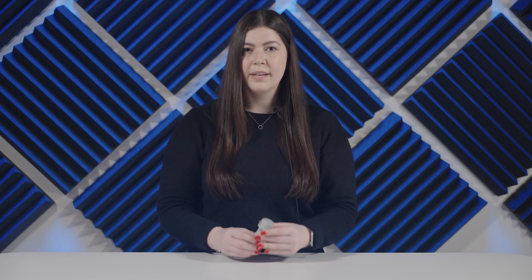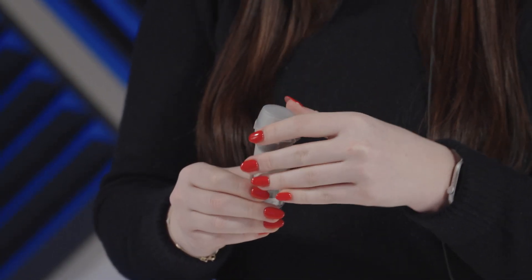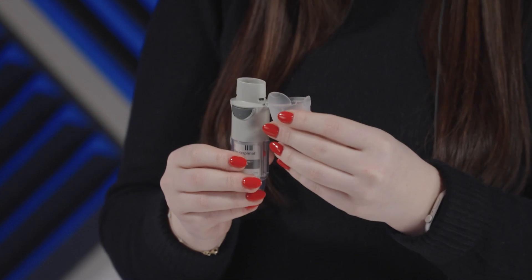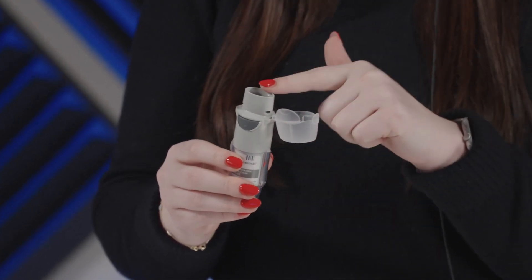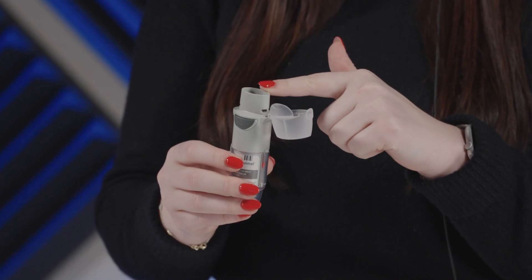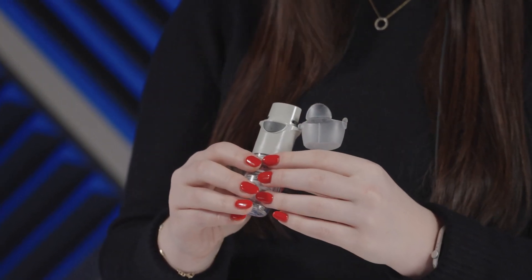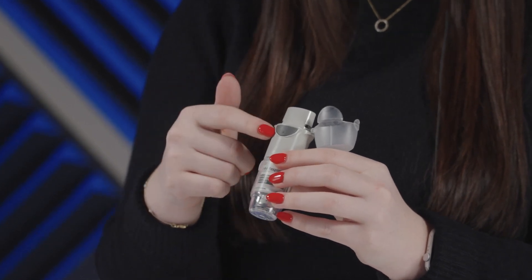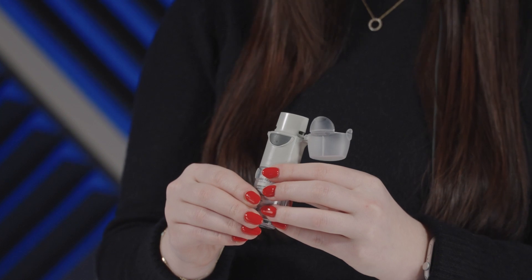For daily use, remember the acronym TOP: Turn, Open, Press. Similar to the steps for priming, you're going to turn the clear base in the direction of the arrows until it clicks. Then you're going to open up the cap. You'll breathe out slowly and fully and close your lips around the mouthpiece, pointing the inhaler to the back of your throat. Then you'll take a slow, deep breath in and press the dose release button. You'll then hold your breath for 10 seconds or as long as you're comfortable.